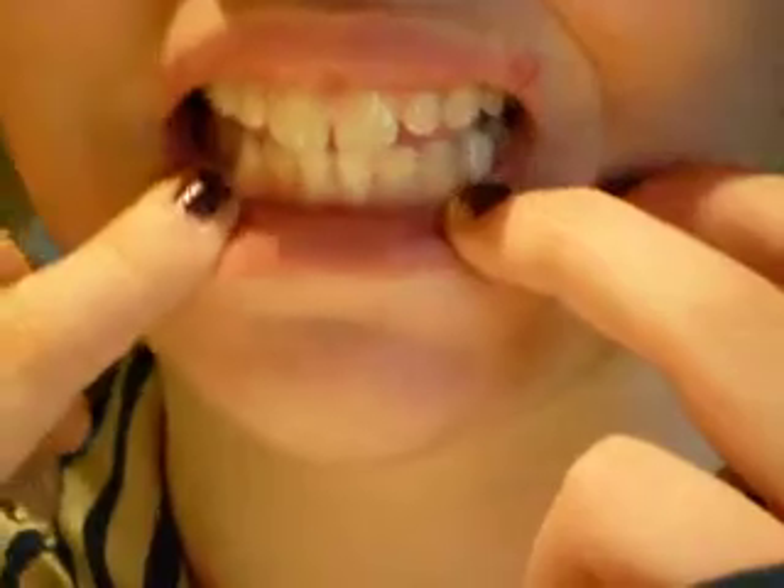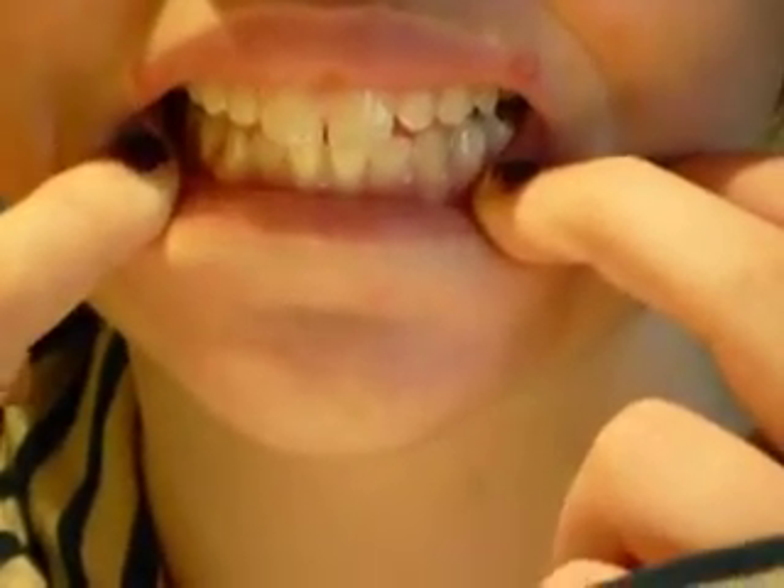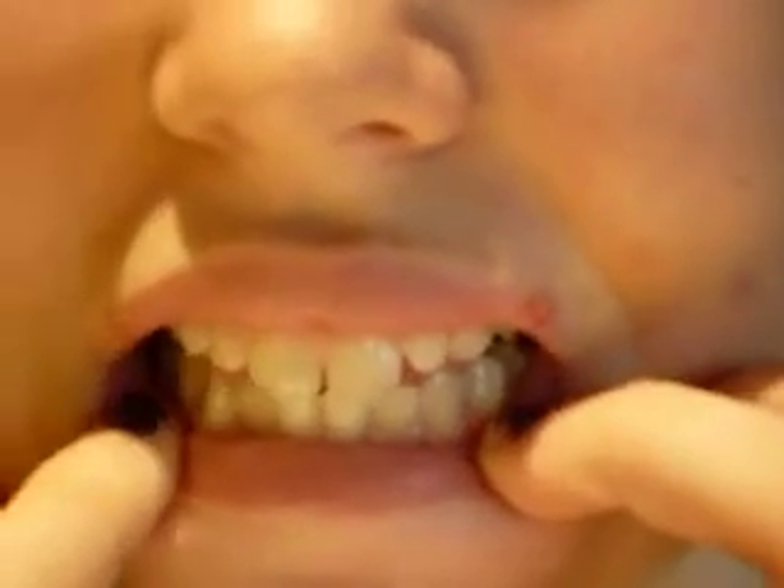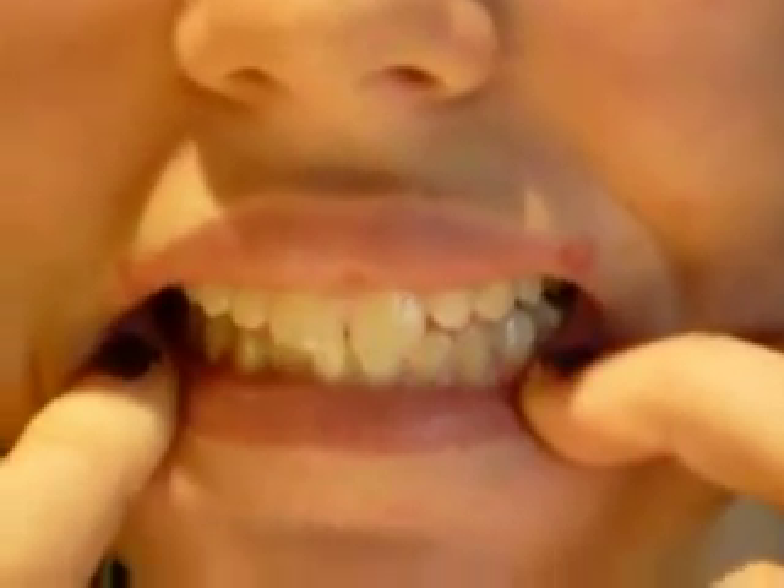So smile at me again so I can see all your teeth. Can you pull your lip down so we can see the uppers? Now bite down on your back teeth. Bite back where you were originally. Now that's forward — now go back. Remember where your jaw was? Now it shows really how far your jaw is back.